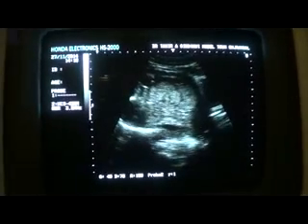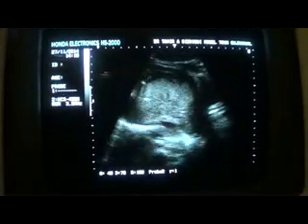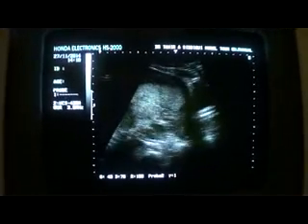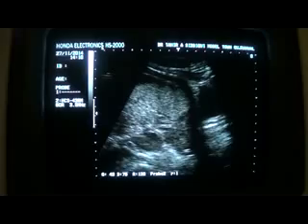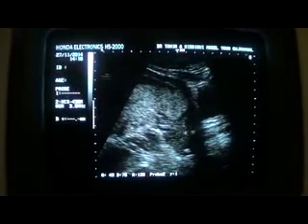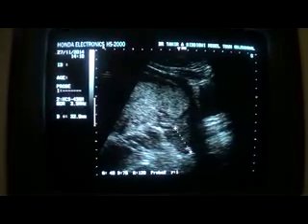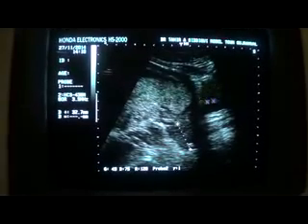Now this is an ultrasound study of a patient who has been referred to rule out any fetal anomaly. She is gravida 4. You can see first of all that this is the cervix. The length of the cervix is 3.2 centimeters, which is normal. Up to 3 is considered normal.